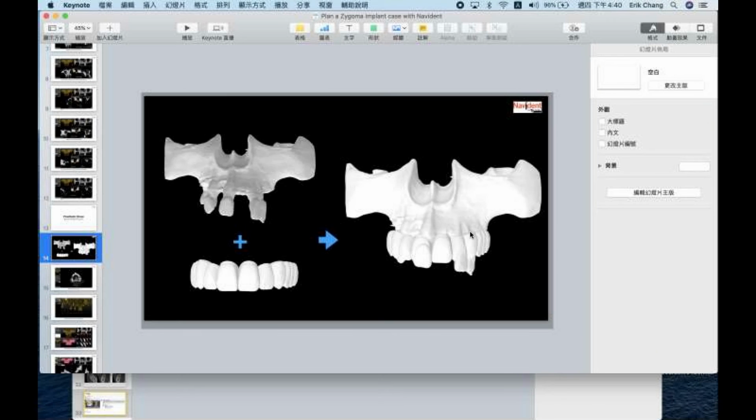Oh, okay. What I'm thinking is that when the technician does the planning, basically they are based on the intraoral scan, right? So I think they might have some STL file technology they can superimpose back easily and automatically. So you get these files from the lab technician. Yes.